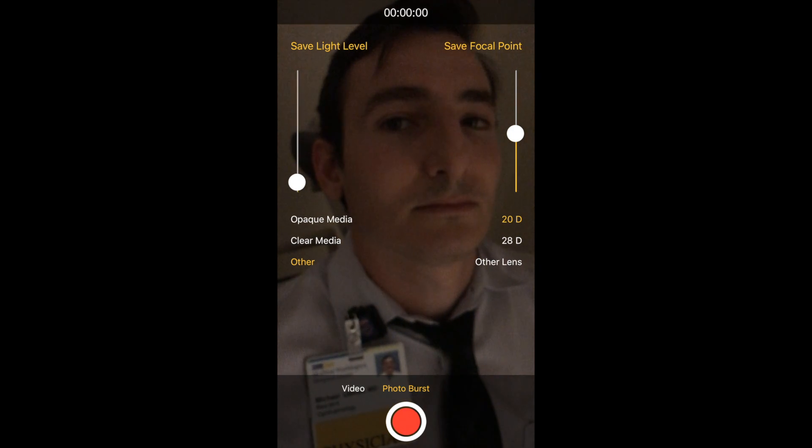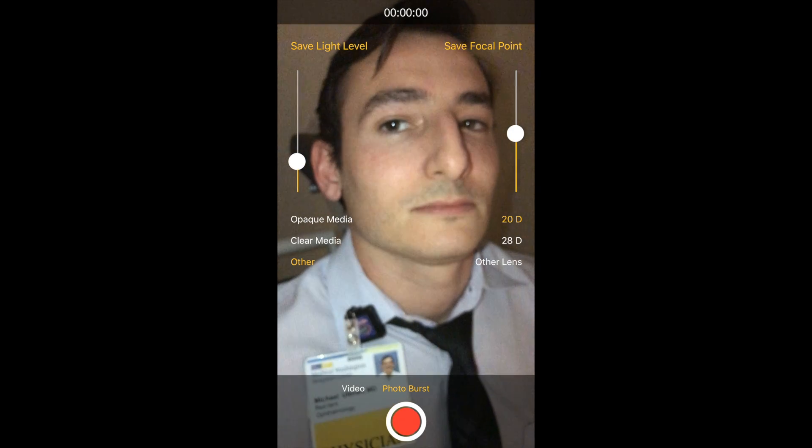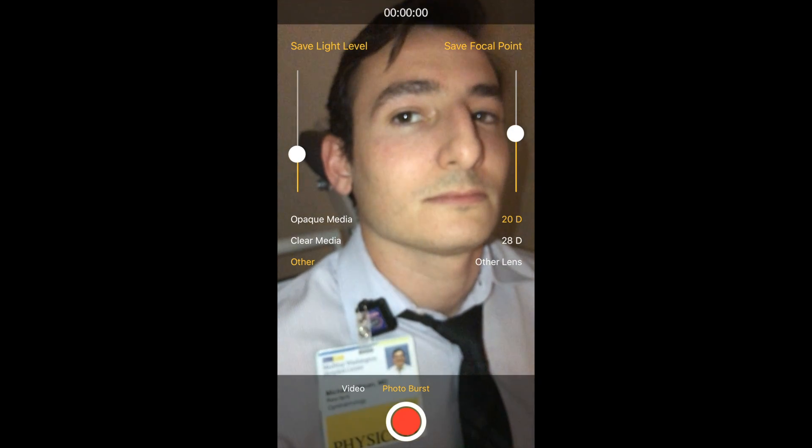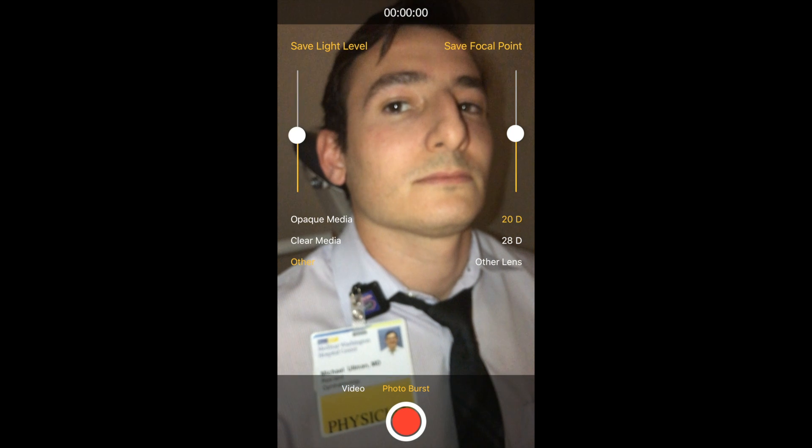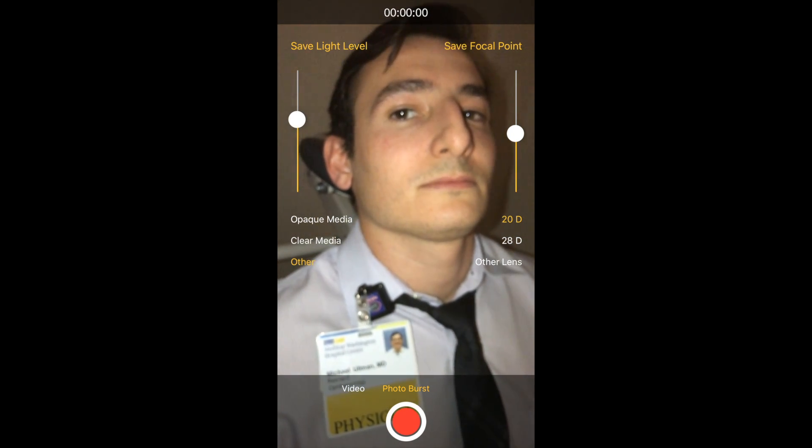You adjust the light level to get a good red reflex. Sometimes it's hard to actually see a red reflex — don't worry if you don't see one.